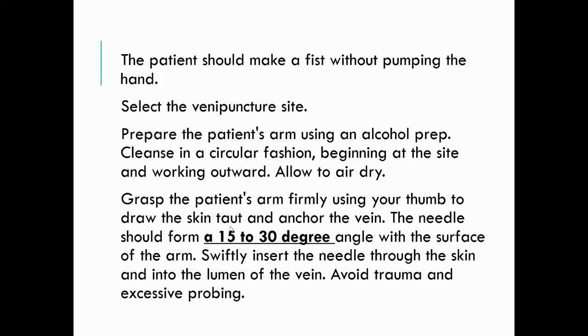So, the patient should make a fist without pumping the hand. So, mukumo sila, pero dapat dili sila mangusog og pag-ayo. When you are about to check for the vein nga asa ka mo ko again, imong first nga bulungon kay dito jud ka sa median cubital. And next imong option kay ang cephalic, then last imong option kay ang basilic.